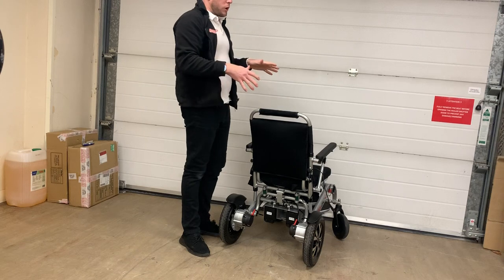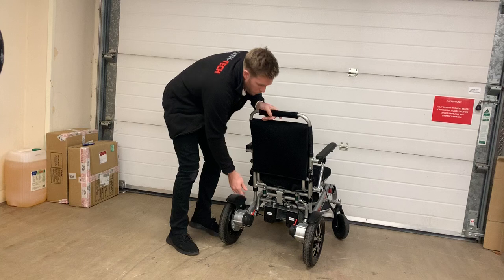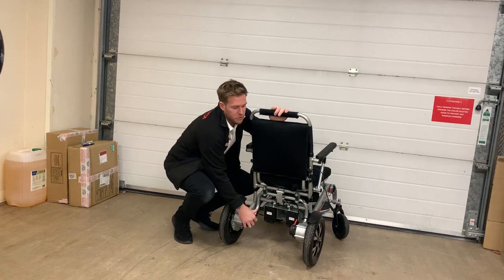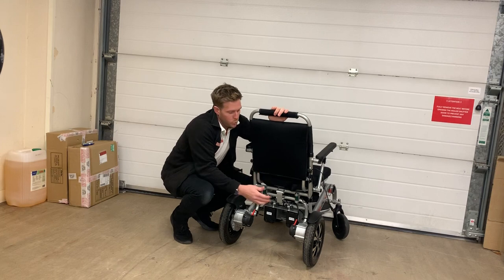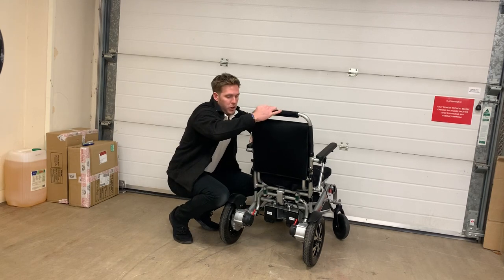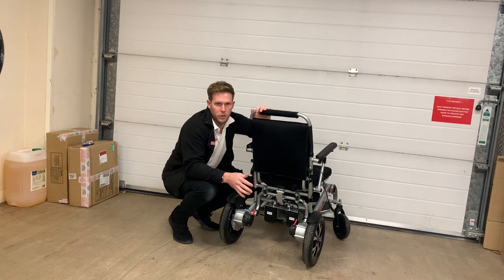I'm going to work my way around the chair and talk about it. What we have here are some red levers — they're attached to the motors and this disengages and engages the motors. When they're back like this and the chair won't move, that means you're in electric mode — a bit like a handbrake being applied to the chair.